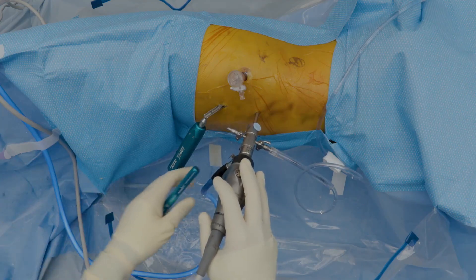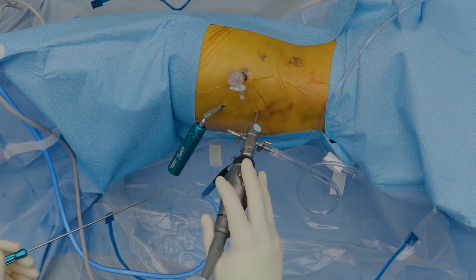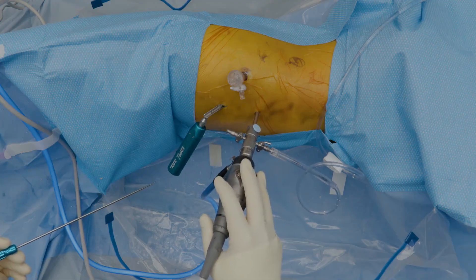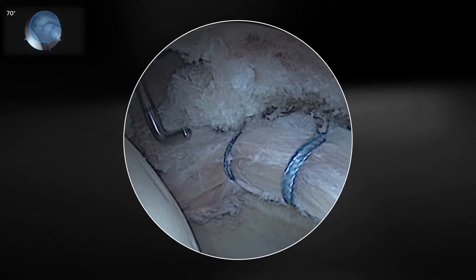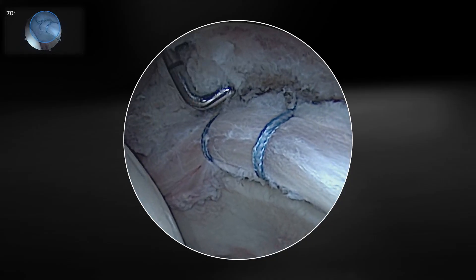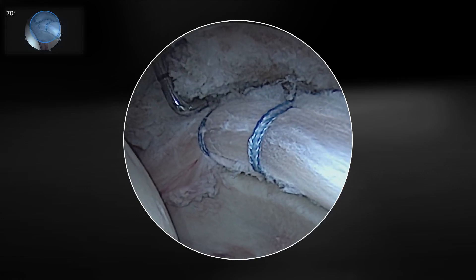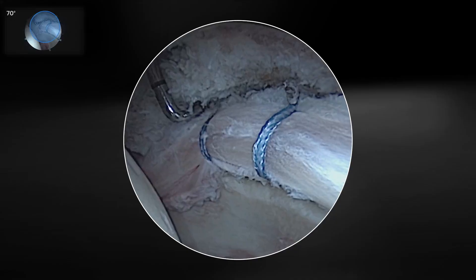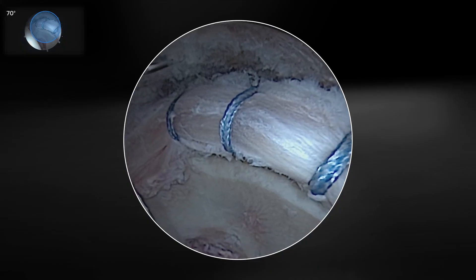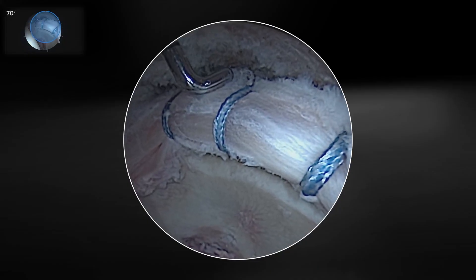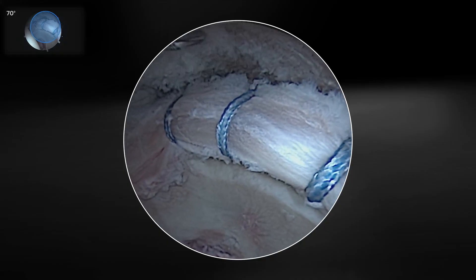The setup and management for this procedure is routine — the same things we would do for routine management of a hip impingement case. We've set up this case here to show that we've already managed our rim lesion and our area of focal retroversion and impingement, and part of that is managing an associated labral tear. You can see that's been nicely refixed with three 1.8 millimeter fiber tack anchors that have nicely restored the suction seal and refixed the labrum.